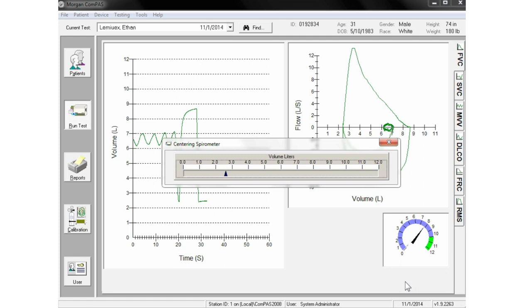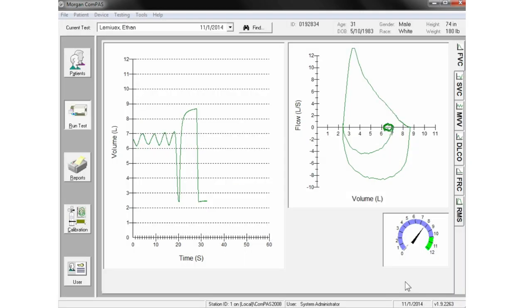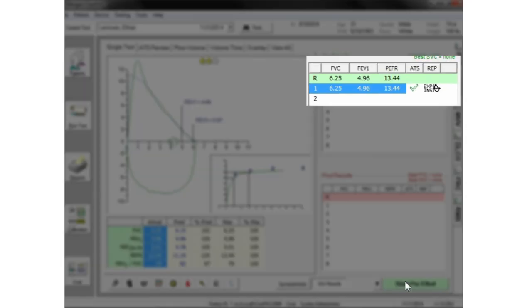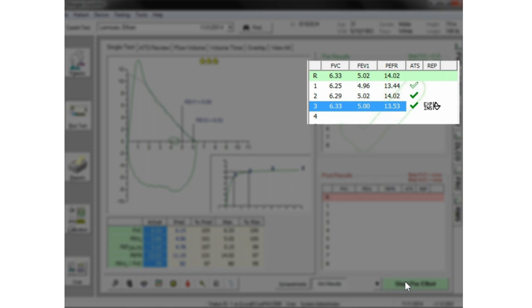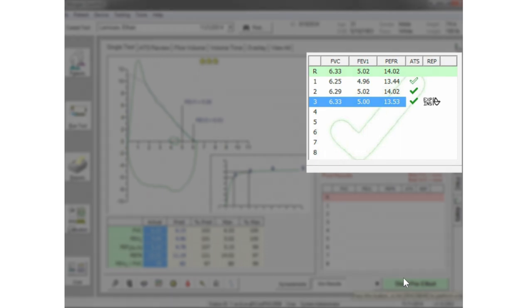At the conclusion of each flow volume effort, the spirometer will be automatically returned to its center position and tests are evaluated for ATS acceptability and reproducibility. A hollow checkmark indicates an ATS acceptable effort. Solid checkmarks indicate which efforts also meet reproducibility. When full ATS reproducibility has been achieved, a large checkmark confirms that good flow volume testing has been accomplished.